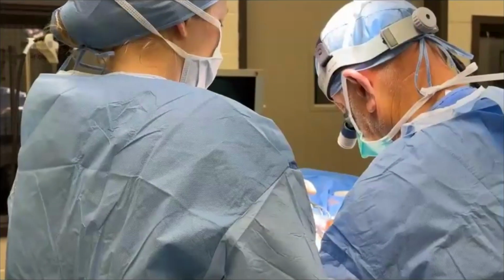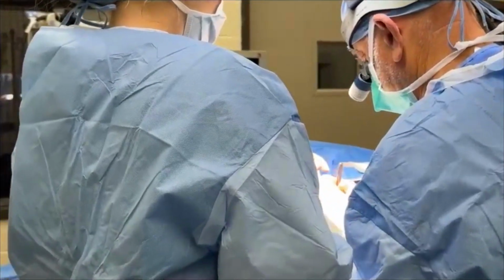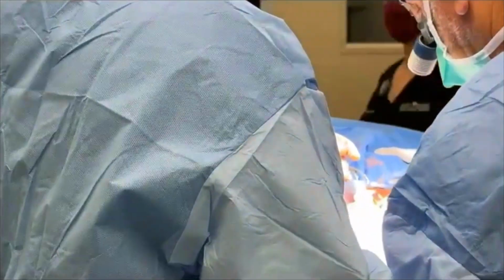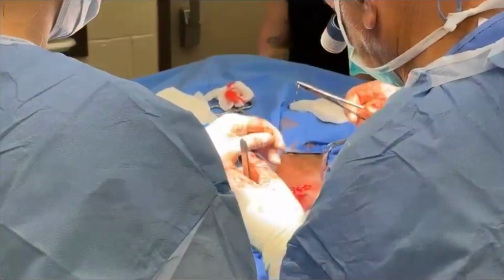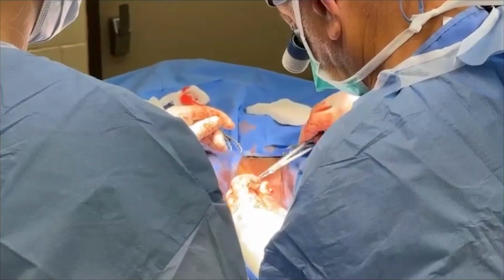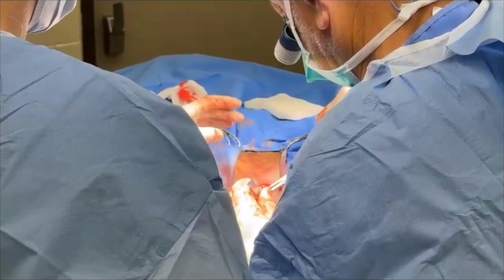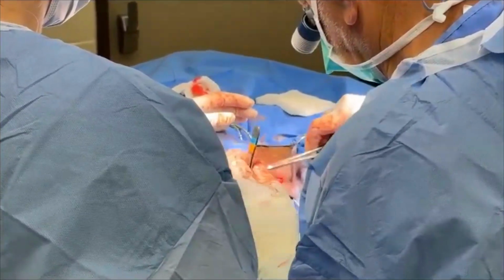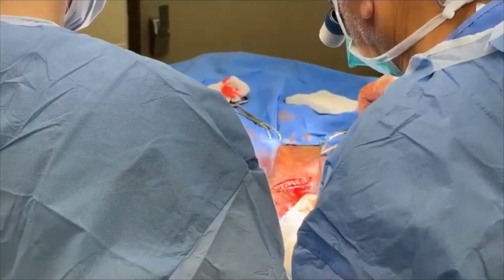So now are you starting to suture the incision? I think I was suturing the drain in there. As soon as I get the drain secured, then we suture the incision. So I'm probably now starting to suture the incision. And usually we close it in 3 layers. But essentially it's deeper fascia, subcutaneous tissue, and then skin. We don't close way deep in there because of all the stuff you might hit that you wouldn't want.